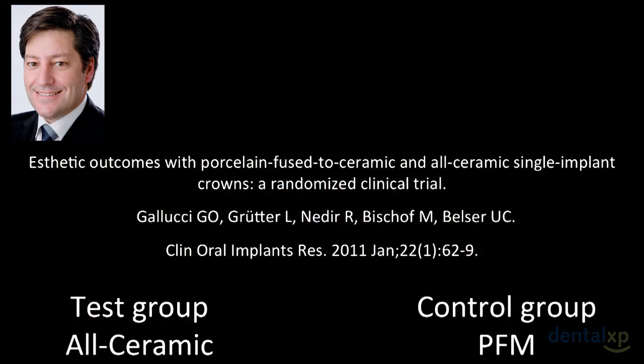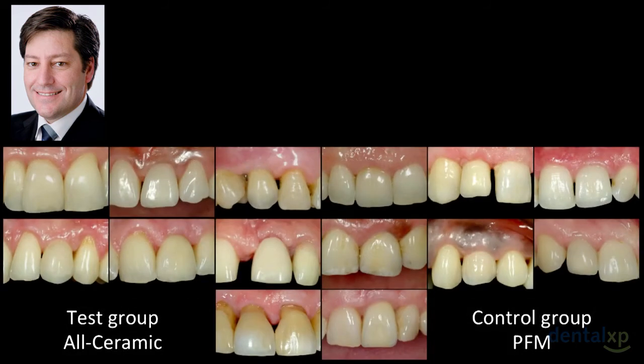So that's why we ran this other study. It was published in 2011. We wanted to see first if the material had an impact. I'm going to now address the question of whether the all-ceramic components and crowns had a difference with the traditional conventional PFM crowns. I show you here, these are all the cases. We did a significant amount of measurements, and you can see that not all of these are perfect or ideal.